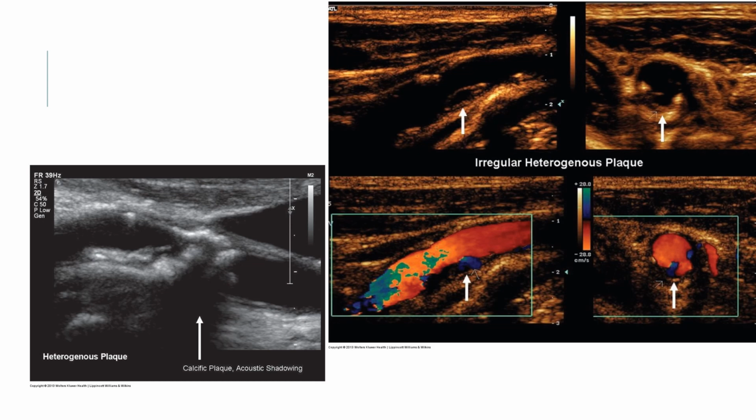Now, whenever you have calcifications in the plaque, it can be very difficult to demonstrate flow through there. It's essential that if there is any flow getting through a plaque, that we document it. So make sure in this case, you probably wouldn't see any flow here, but if you were getting flow posterior to it, we would know flow's coming from somewhere. So you'd have to be trying different angles, perhaps moving to the side of the vessel and angling in through a different window or something like that may give you the ability to see flow through here where it's not being shadowed out by those calcifications.